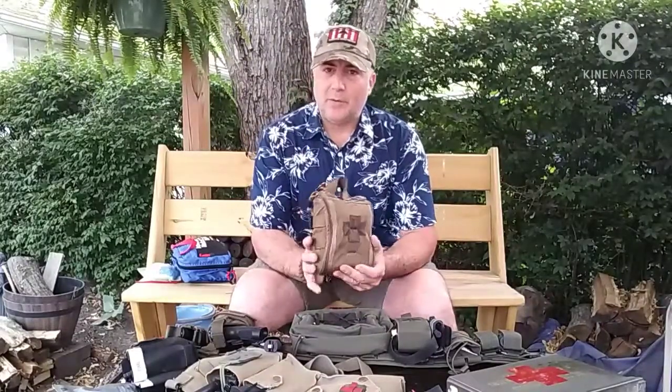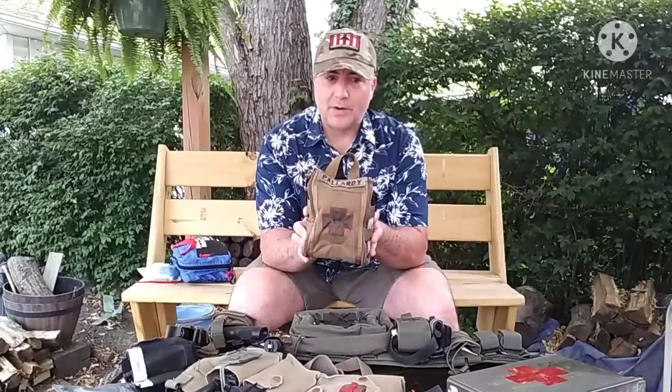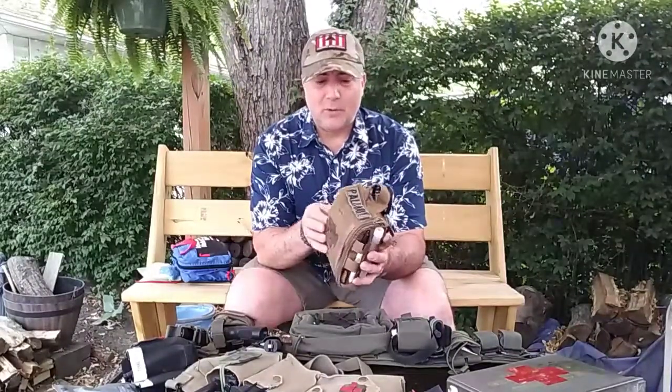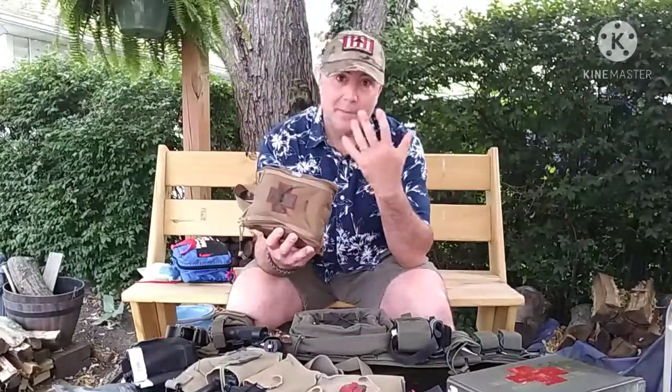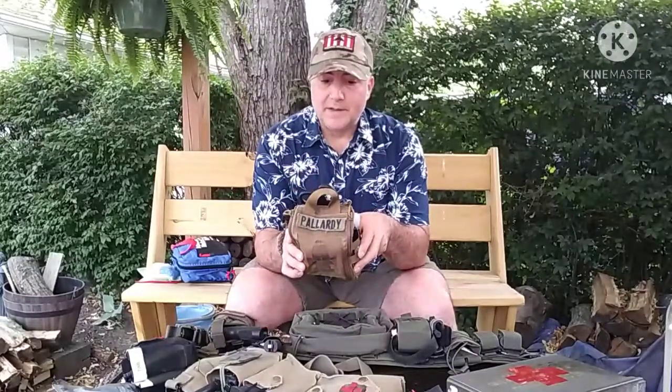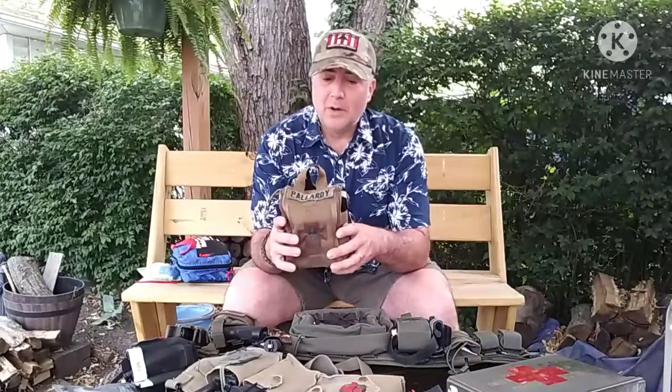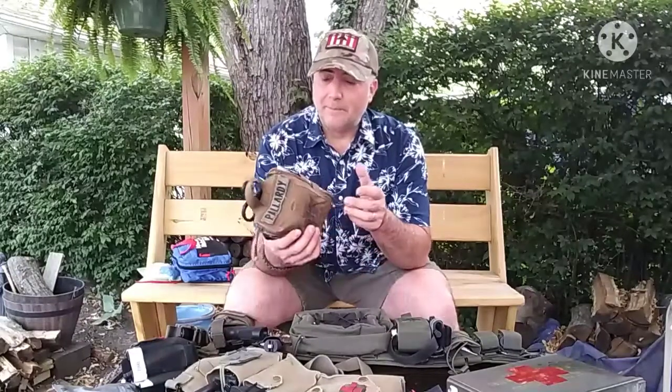And then you get into some of your specialized kits, like a squad level kit where maybe you're your group designated first aid officer, whether it's for a scout patrol, whether it's for a more specialized group, whether it's, obviously, I'm the Modern Minuteman, civilian defense purposes, or if you're in the military, you may have a more robust kit for taking care of several people, whether it's trauma related or whatnot.